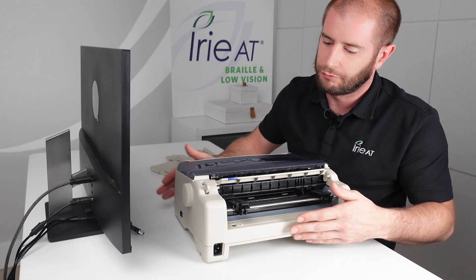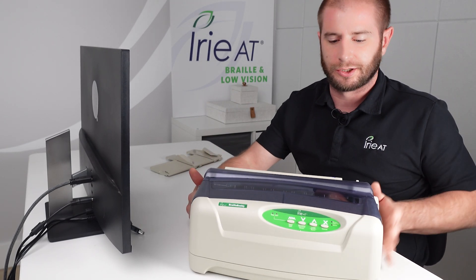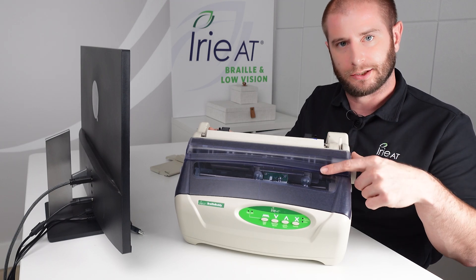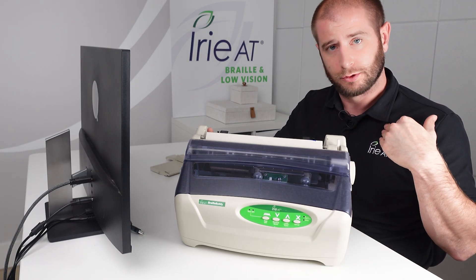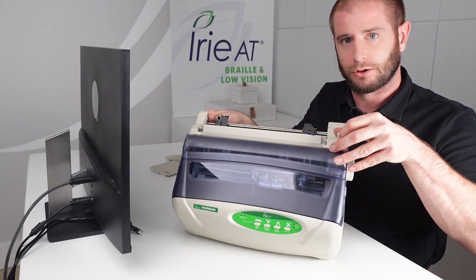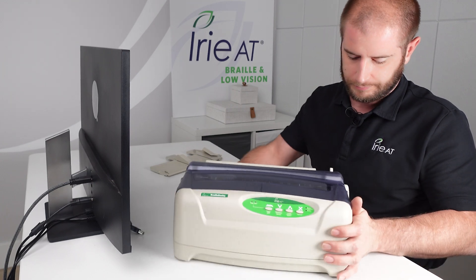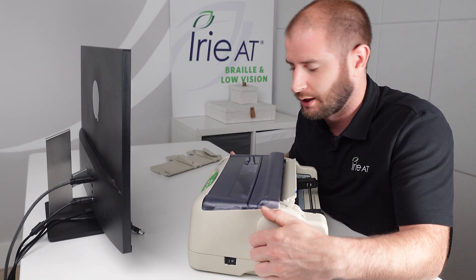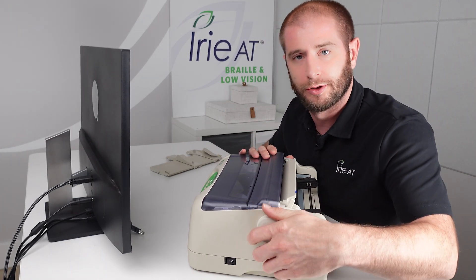Moving around the device, there is a switch on top of the embosser on the right-hand side towards the back. That switch allows the paper feeding mechanism to alternate between tractor fed and cut sheet. If you have it pushed away from you with the front of the embosser facing you, that's going to be for your tractor fed paper. If you flip the switch towards the front of the embosser, that switches it to cut sheet paper. On the right edge of the embosser we also have a feeding knob — if you ever have paper that gets stuck or you need to line the paper up manually, you can turn this knob to adjust it back and forth.